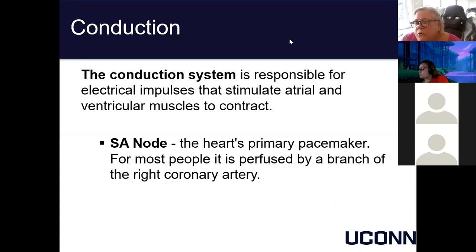It doesn't show you the quality of the rest, or even more importantly, the quality of the contraction. But it does show the electrical conduction of what should be happening from an electrical perspective during those time frames.